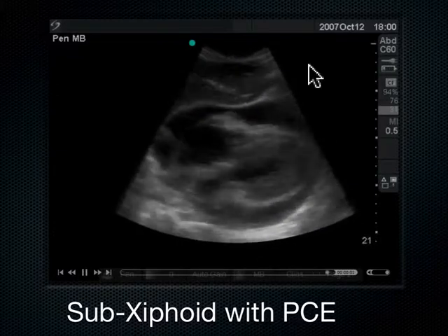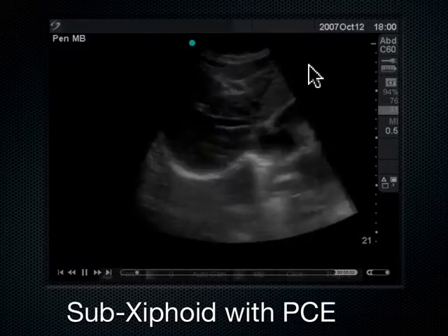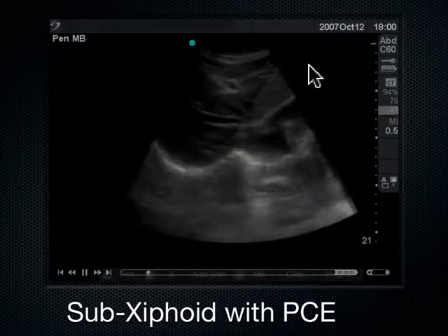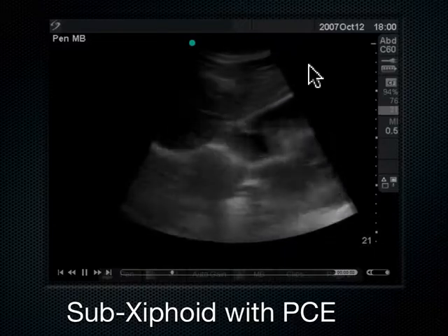The problem is when you have somebody who's a big drinker and a big smoker, where now they've got a tiny cirrhotic liver, and now they've got these huge COPD lungs, and then you're wondering if they have a heart in there at all. It's hard to find. You really got to roll them left lateral decub, have them take an enormous breath and hold it, which of course they can't do because they're such bad COPD, and this whole thing becomes a very challenging exam.